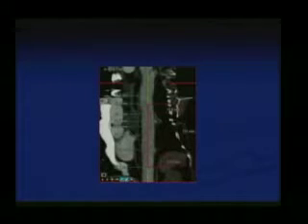The hypogastric arteries are open. There's no prior EVAR done, so the lumbars, everything is okay. And with the stent graft, as we were talking earlier, beyond 20 centimeters the risk of paraplegia goes higher. So we did explain all the risks and benefits to the patient and the family, and we elected to proceed with the stent graft in this case.